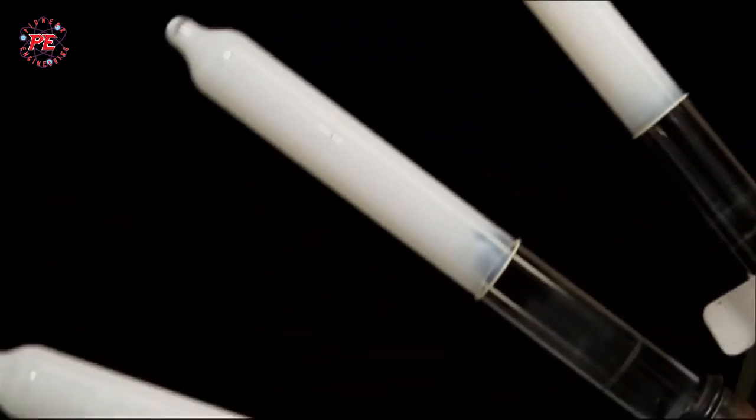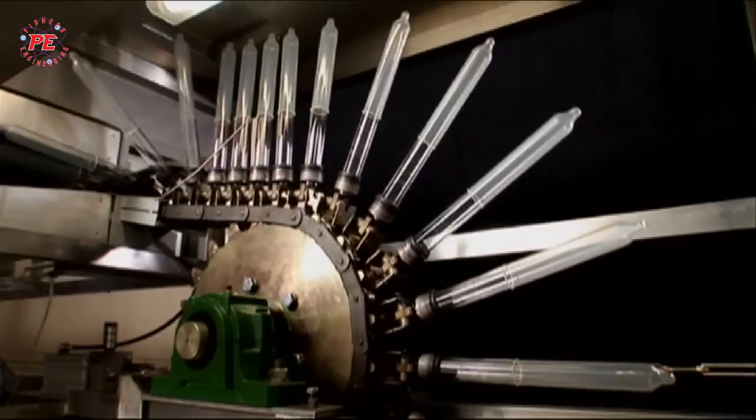All immersion temperatures as well as speed are continuously monitored to ensure the smooth operation of the fully automated immersion chain.